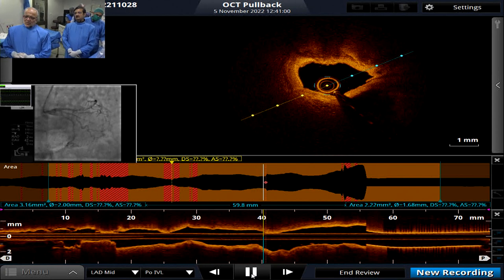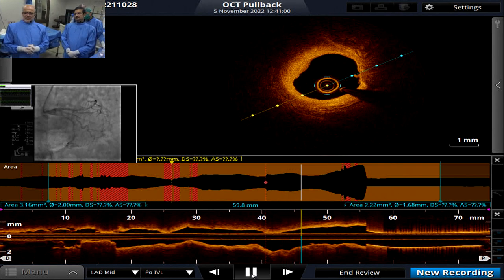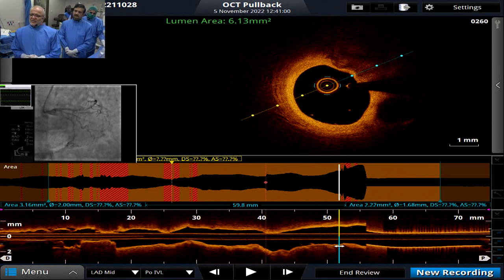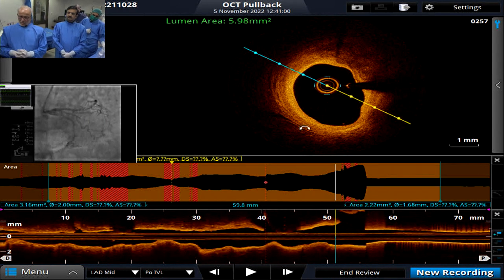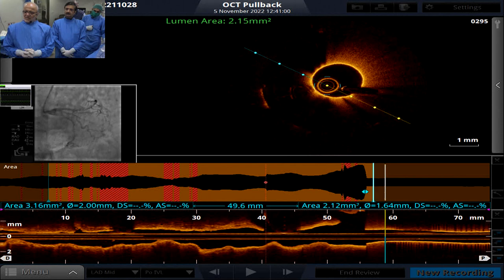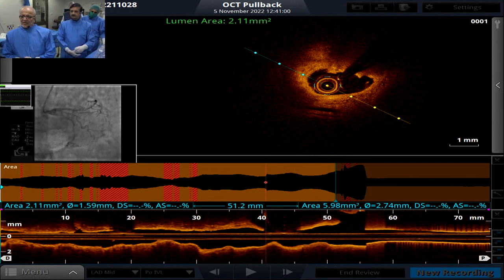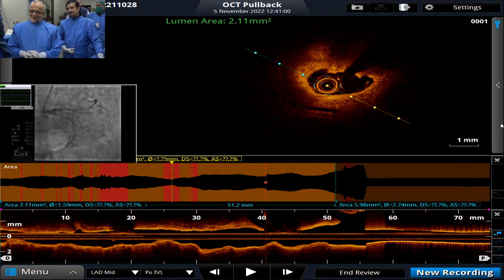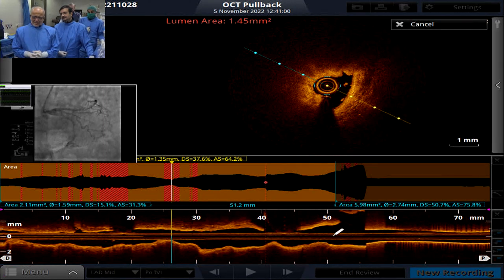Now, my question to you guys is, one stent long or two short, medium level stents? Proximal and distal landing zone, we decide first. This looks okay to me. There is calcium, but it is okay. Most of the area looks good. Just after diagonal, okay. Fine. I think two stents will be better. Short, that is a safe strategy, actually. It'll make your life a lot easier. I agree, and there is no point in showing off. Ultimately, we should be concerned with end result.